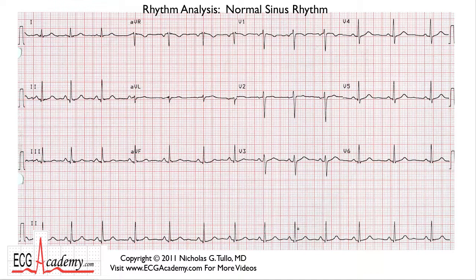In my years of practice reading ECGs, I find that diagnosing heart attacks and hypertrophy and all the common electrocardiographic diagnoses when you're looking at a 12 lead is pretty easy once you know what you're looking at. But you know what's challenging? The rhythm. I think figuring out the heart rhythm on a complex ECG is probably the hardest thing to do.